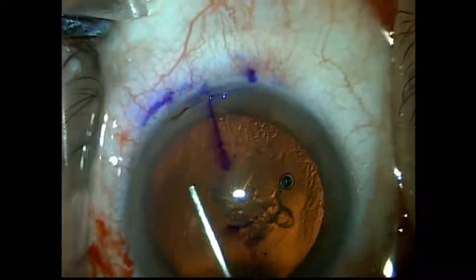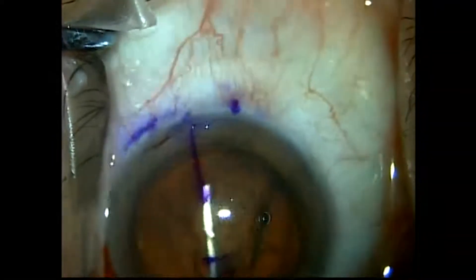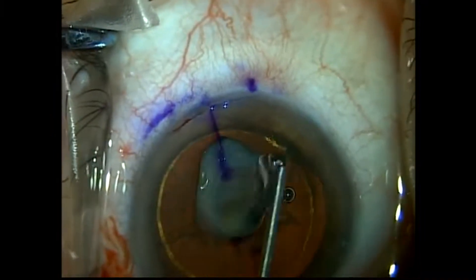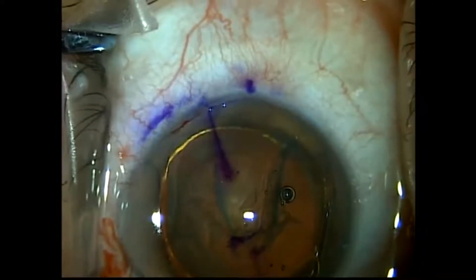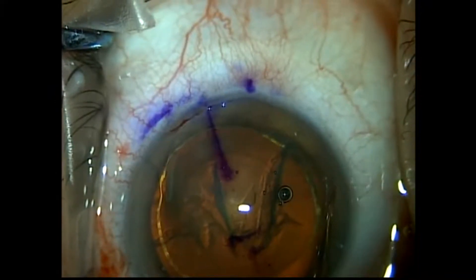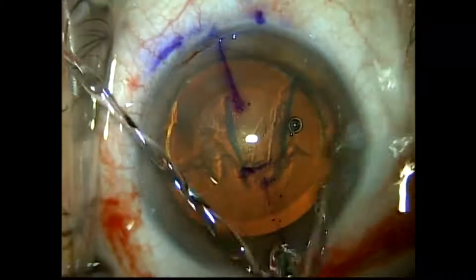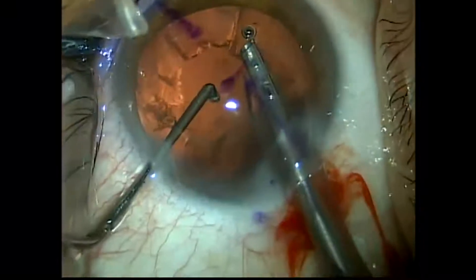I do hydro-dissection. In the interest of time, I will edit a lot of the FACO and IA out of the video because those are standard techniques that most ophthalmologists are very familiar with. We used the AMO Signature FACO emulsification system with an Ellipse FX handpiece.